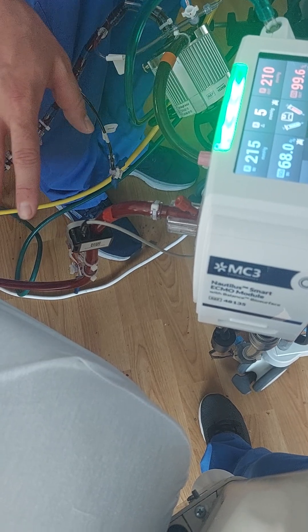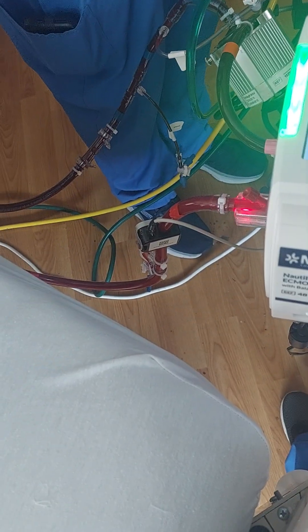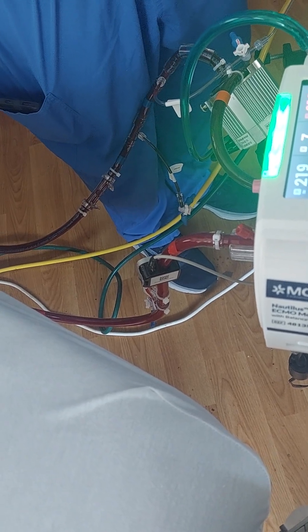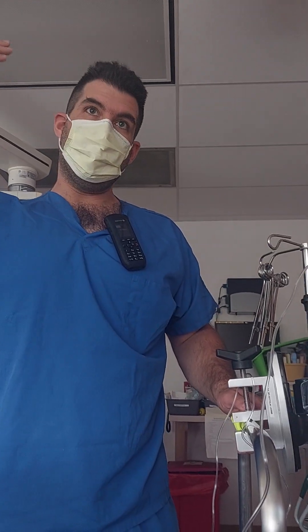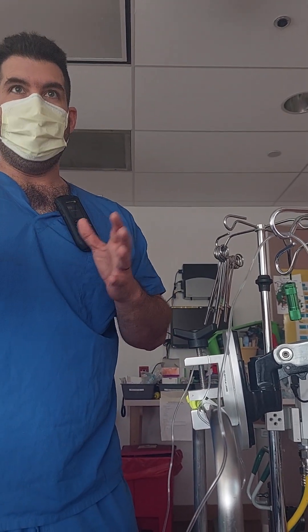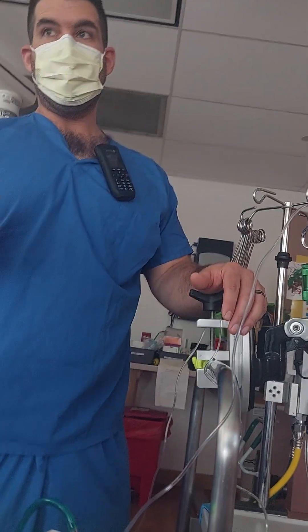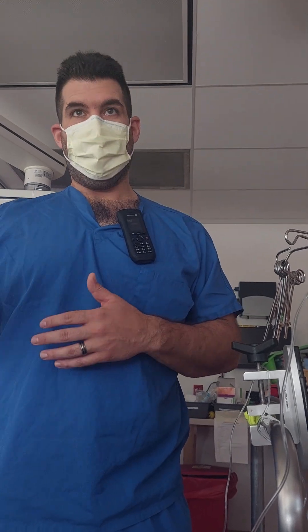That diffusion process takes place while blood transfers from the inlet of the membrane on the venous side until it leaves on the outlet side. The color of blood entering the membrane is much darker than blood leaving — the blood exiting the outlet is bright red, meaning gas exchange has already taken place. This highly saturated blood is then returned via a separate cannula positioned in the arterial circulation — placed surgically into the carotid artery, with the cannula tip terminating closest to the aorta — providing oxygenation and perfusion to the patient's end organs.